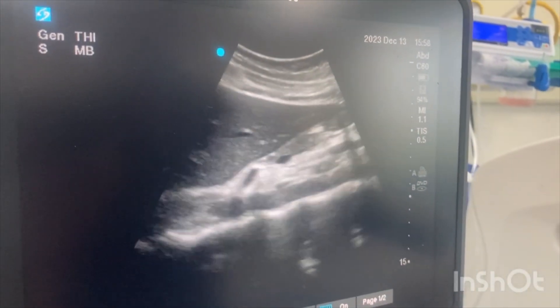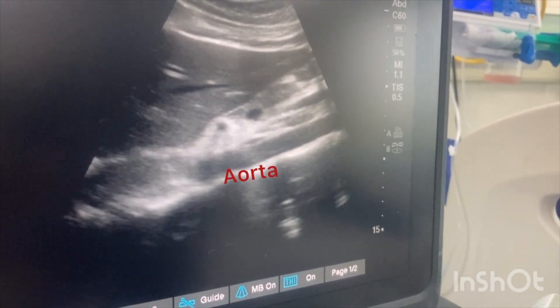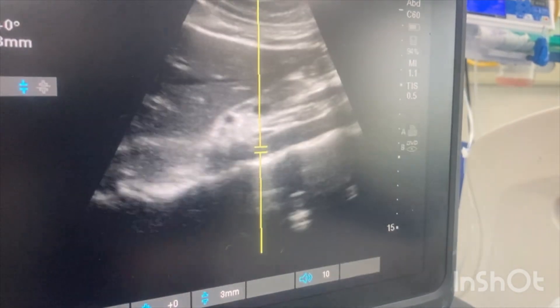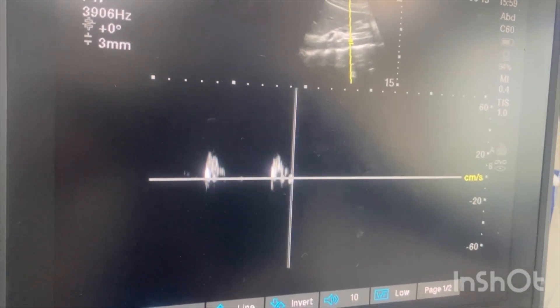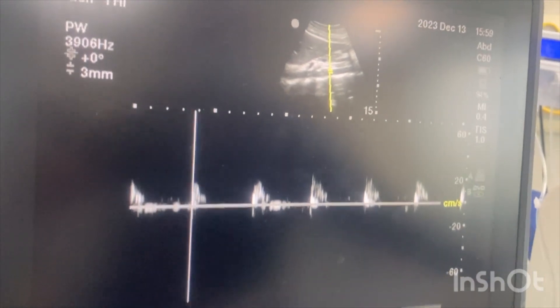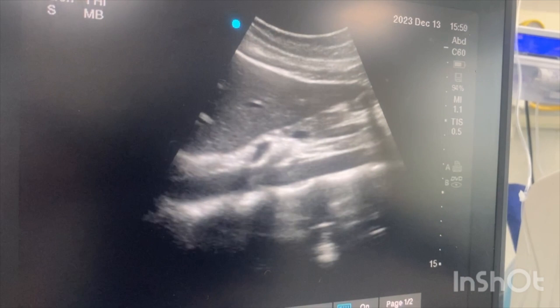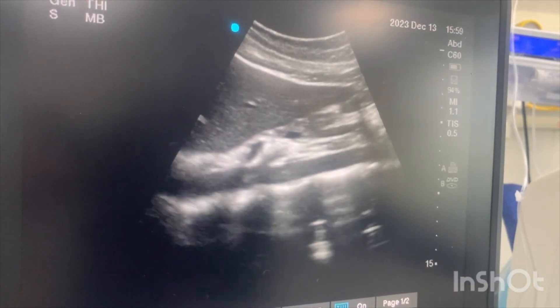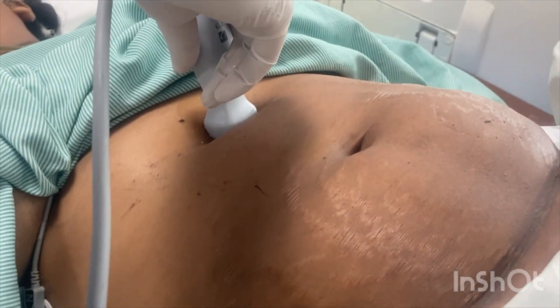To see the aorta, slide the probe slightly to the left side. You will see a hyperechoic line that is the spine, and the aorta is a pulsating structure just over it. Apply Doppler and you will see a pulsatile waveform, confirming the aorta. Now I am going to perform the same steps with the low-frequency curvilinear probe.